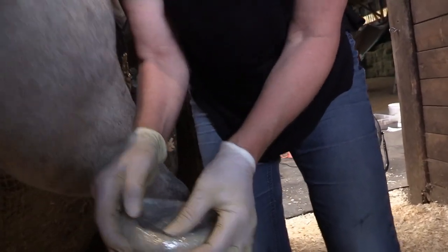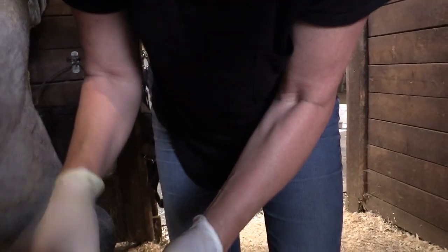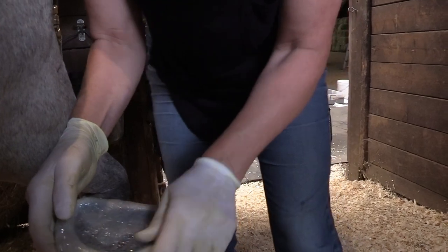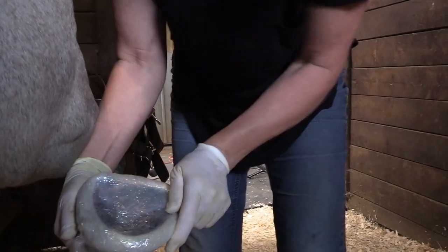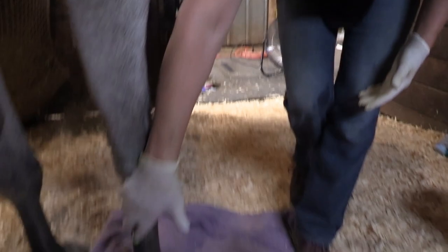So do you see how we got a nice little lip there? Feel it? Yeah, I can see it actually. And I might take a little bit of that sole out there. I see there's a piece sticking right up there, and that will hurt. So I might remove a little bit of that. Okay, then have another bit.